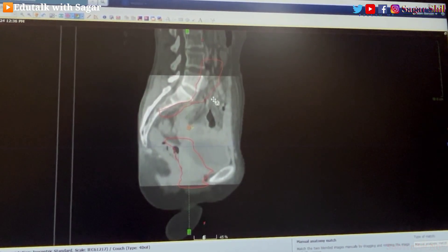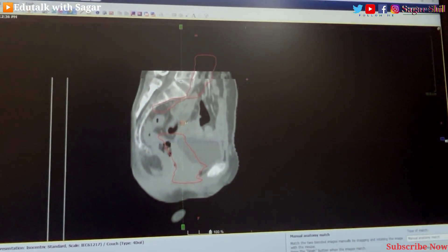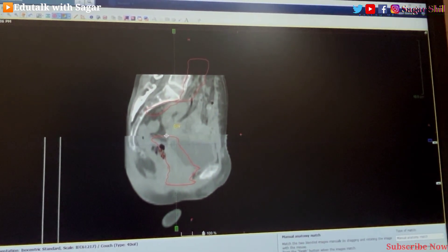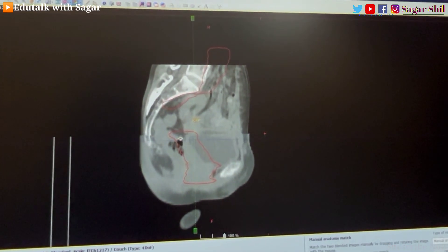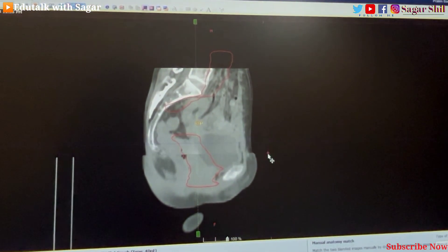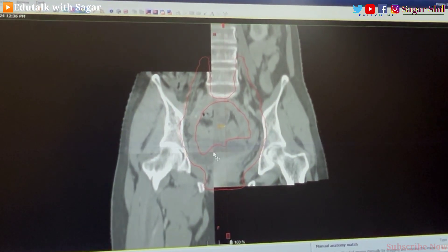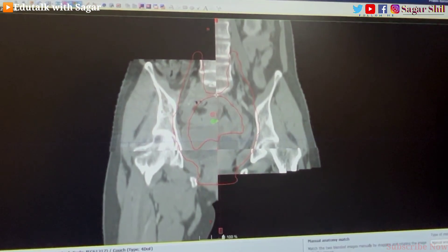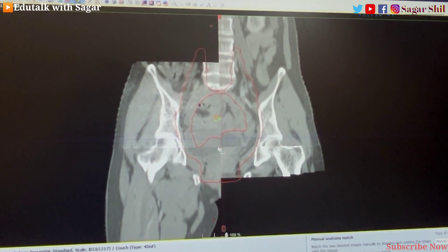Here is the sagittal view. You can take a split window and see the variation. I am matching here and there is some variation in the coccyx area. For endometrium cases, focus on the lower side first. This bone you can also match like that. There is vertical, longitudinal, and lateral matching. Between the two, you can see the variation I am creating — if variation is like that, you should match accordingly.